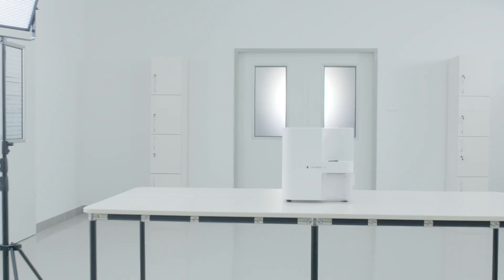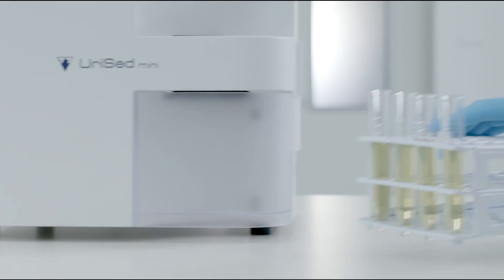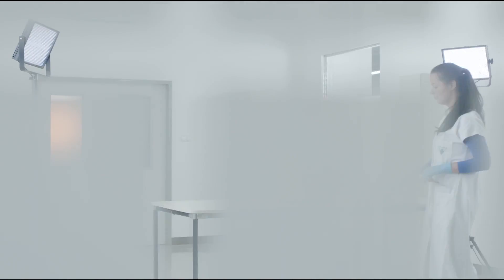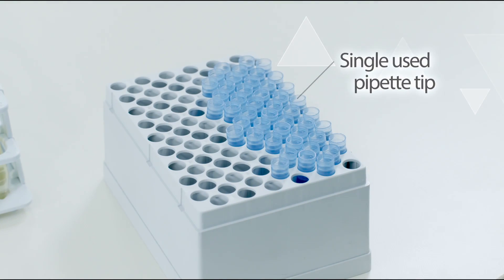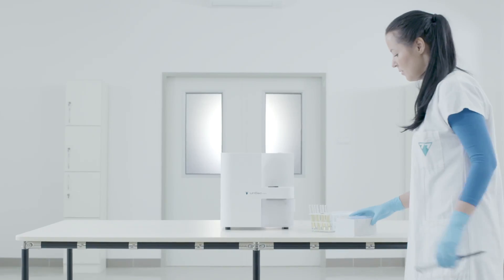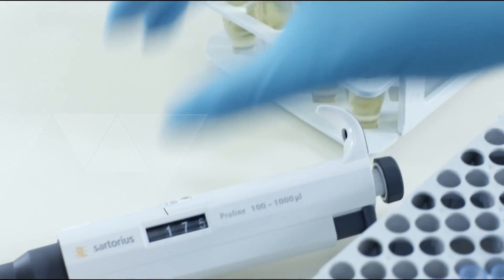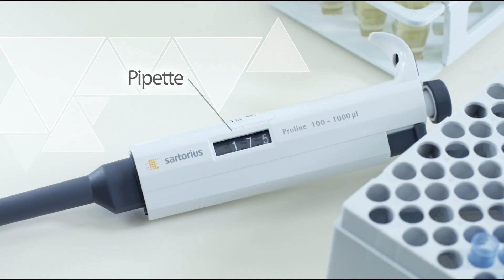The URISED Mini operates with single-use cuvettes, which are inserted into the instrument via a cuvette holder containing 50 pieces. The appropriate pipette with pipette tip has to be prepared as well for sample aspiration.